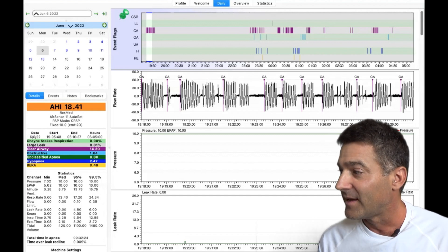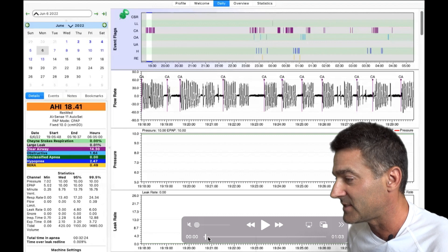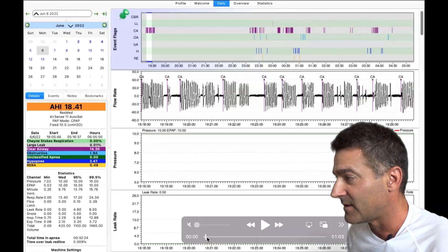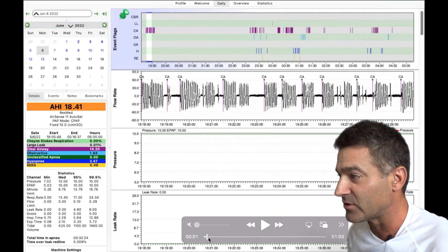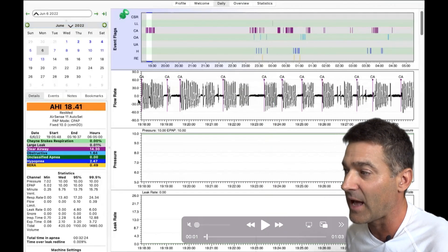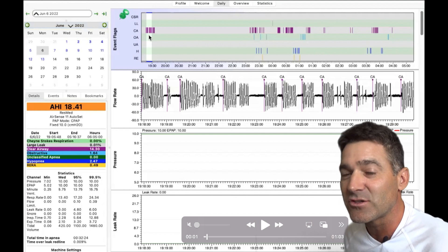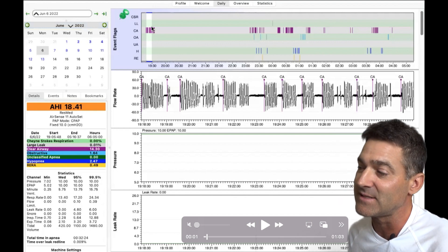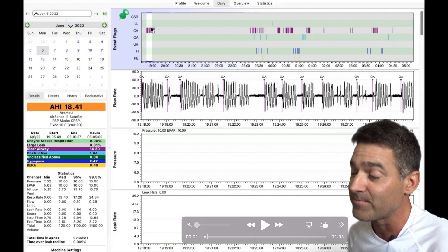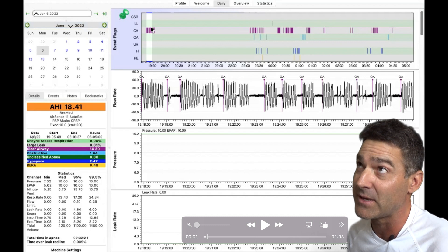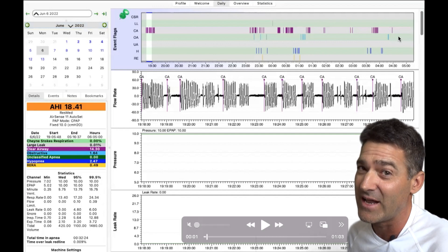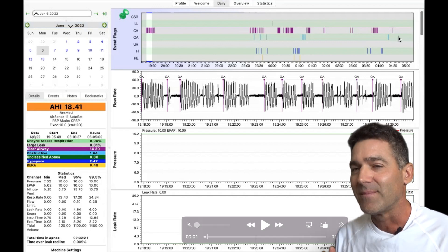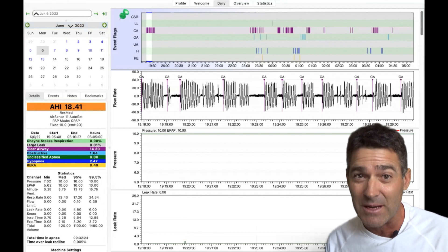Here is what we're seeing. We are seeing several clusters of central apneas. If you see clusters of central apneas either at the very beginning of your night, and maybe you see a cluster at the very end of your night, let's not worry about that too much.